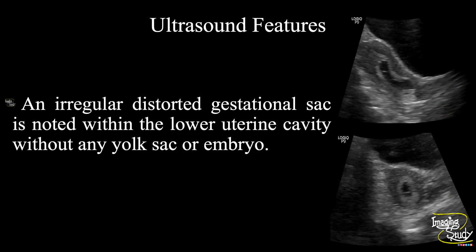In summary, an irregular distorted gestational sac is noted within the lower uterine cavity without any yolk sac or embryo, suggesting this as a case of incomplete abortion.